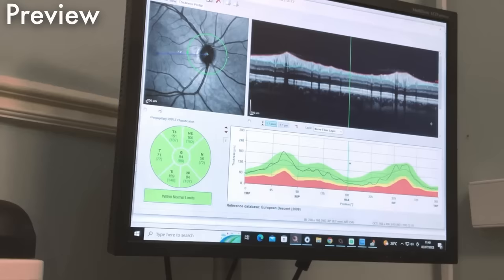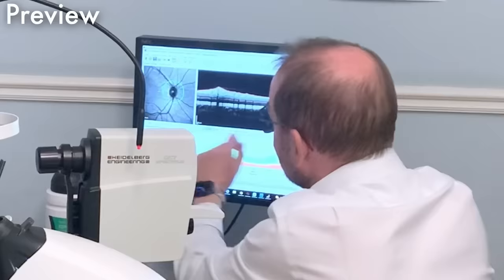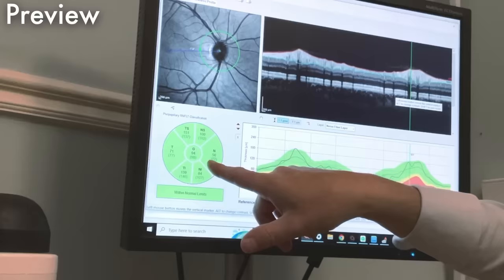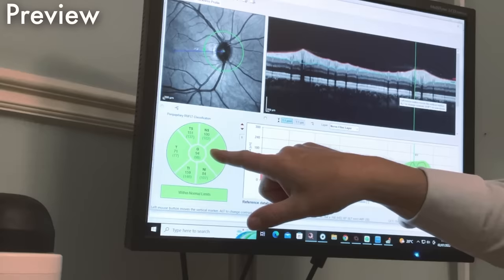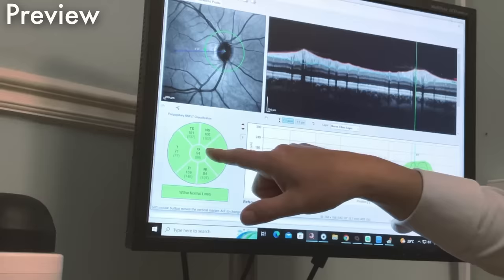So if we slide this over here, this is a cross section through there of the thickness of the nerve fiber layer. So you see, as I drag this over, it's a different cross section all the way around. And this is it mapped out, showing the thickness. And then over here, it shows the quadrants of the areas of the thickness. And it's got your thicknesses, and then it's got averages as well. So, and that all looks really healthy.